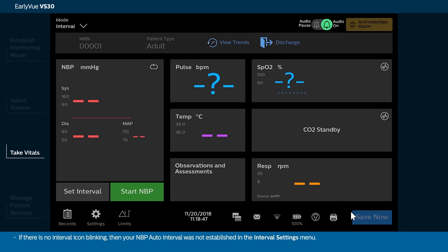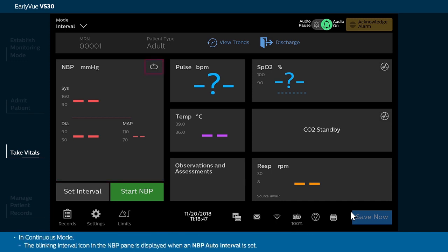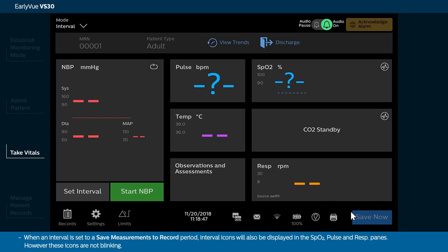If there is no interval icon blinking, then your NBP auto interval was not established in the Interval Settings menu. In continuous mode, the blinking interval icon in the NBP pane is displayed when an NBP auto interval is set. When an interval is set to a Save Measurements to Record period, interval icons will also be displayed in the SPO2, Pulse, and Resp panes. However, these icons are not blinking.